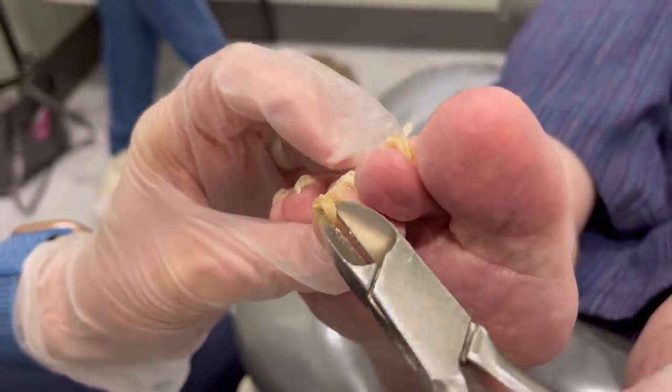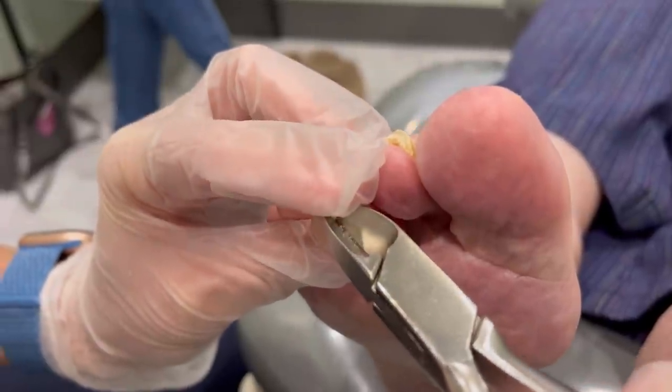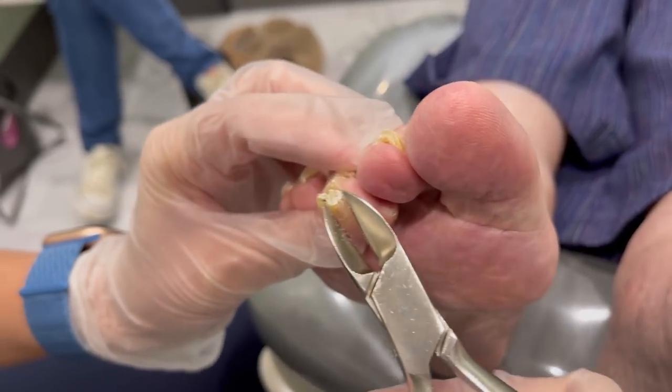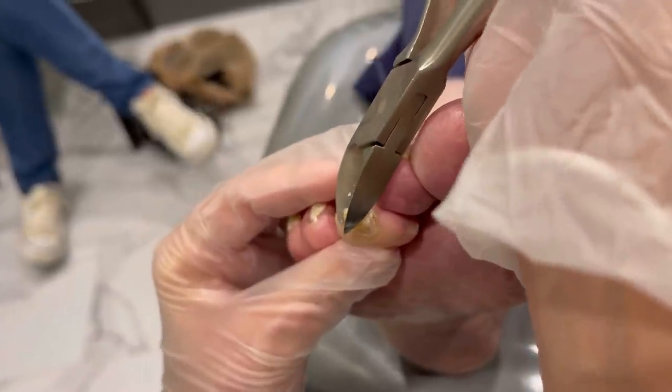So I'm gonna trim it gently. I'm so sorry, I don't want to hurt you. A lot of times if you do it with a nipper, because it's not attached fully, this is more comfortable to get the big bulk of it. So if you take a blade straight to it, it's going to be more uncomfortable because it's almost going to just tug and pull at it.